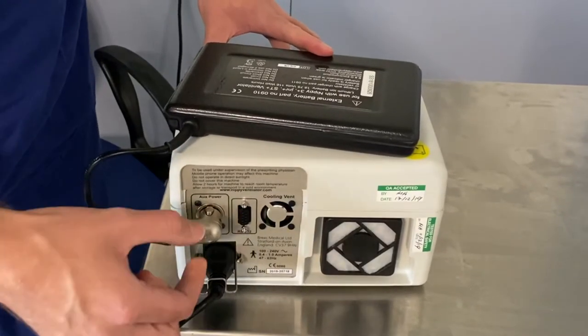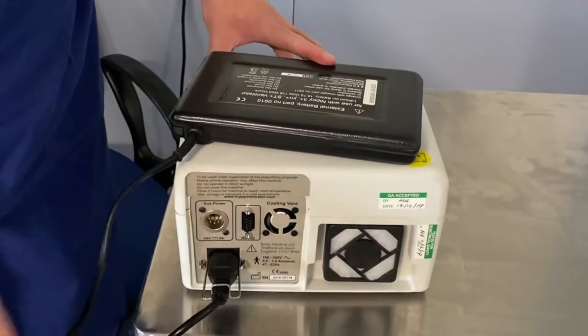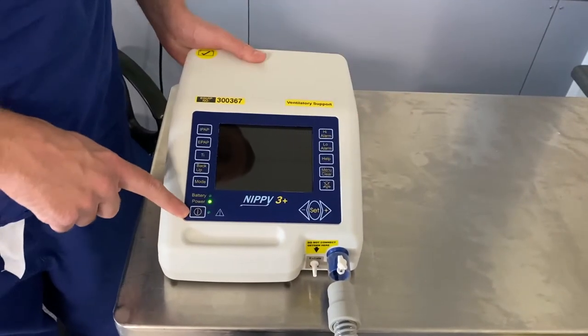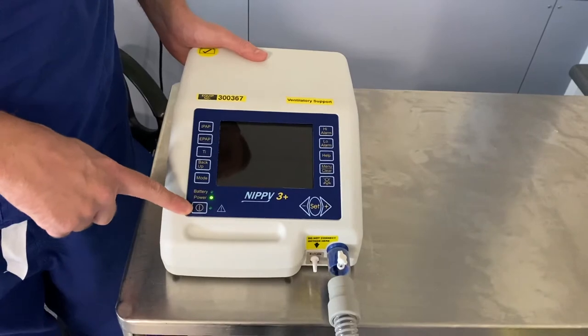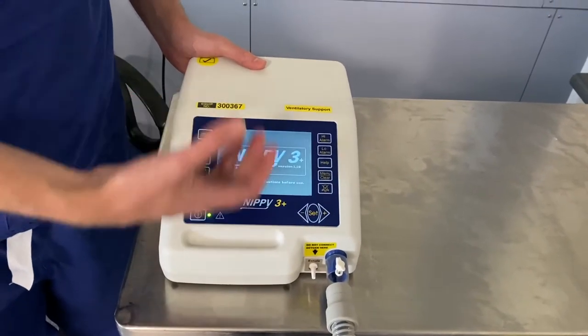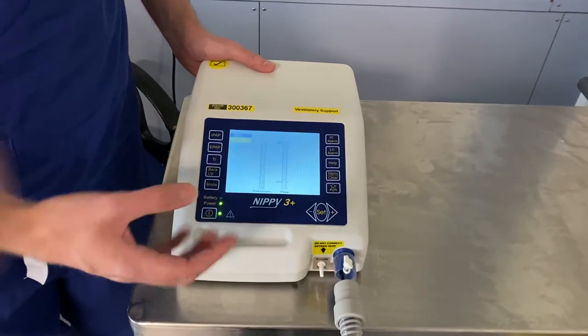If you want to remove the battery, push the button down and pull out. To turn the machine on and off, press the power button here — press it once. It will do a quick internal check before it then starts ventilating and starts blowing air in and out.